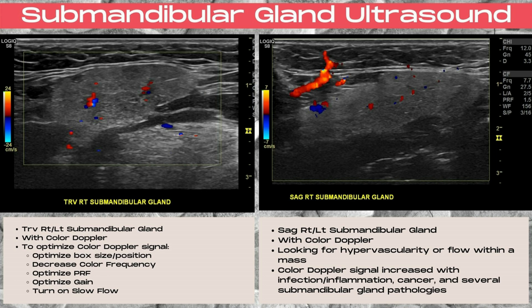Small arteries and veins can often be visualized within the middle portion of the gland. The goal with color Doppler is to look for hypervascularity within the gland or any flow within any visualized masses. The color Doppler signal is going to be increased with infection and inflammation, cancerous masses, and several other submandibular gland pathologies, such as Sjogren's syndrome.